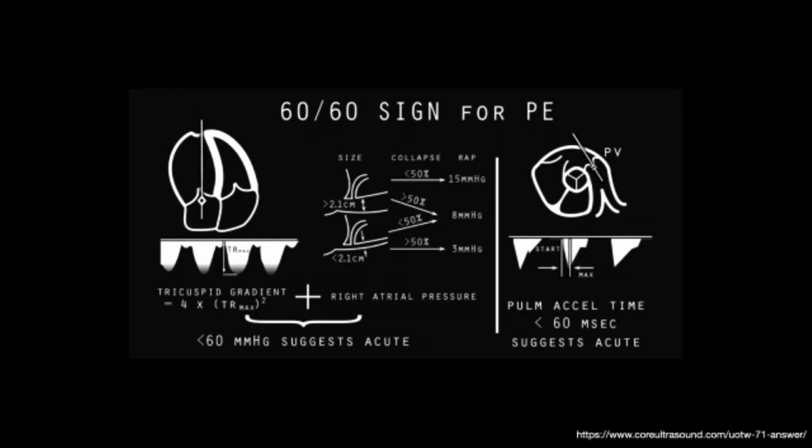So despite doing all of these different measurements, you may not get a good TR signal. And this is where the role of left ventricular contrast or ultrasound enhancing agents comes in. These agents can enhance the contour and the shape of the tricuspid regurgitation jet and other significant Doppler waveforms in the heart. So if we've given contrast, the sonographers will always go and look for tricuspid regurgitation with the use of contrast, and that will bring out the velocity in its best form and its best fidelity in many cases where it is not visible to Doppler in an unaided situation.